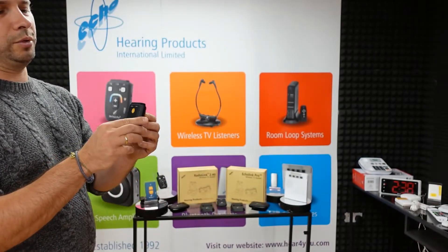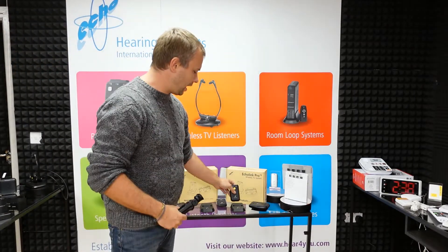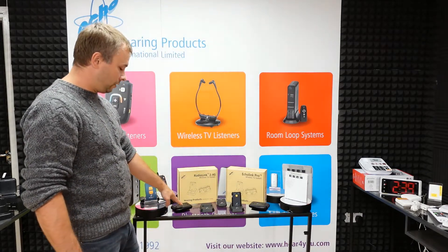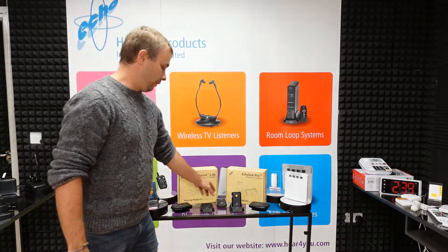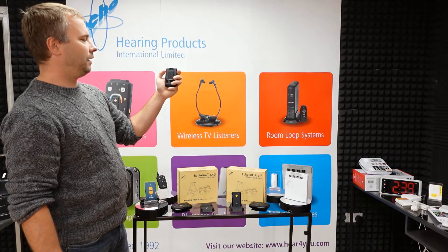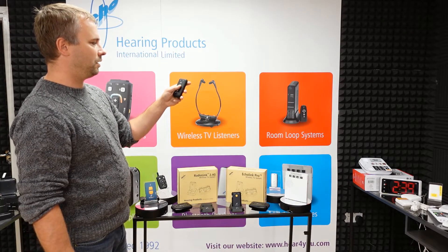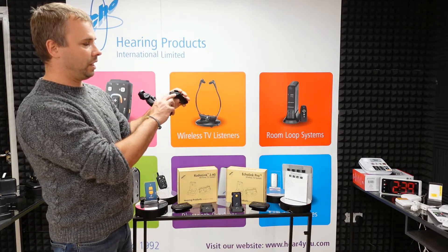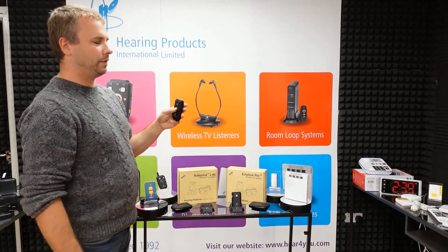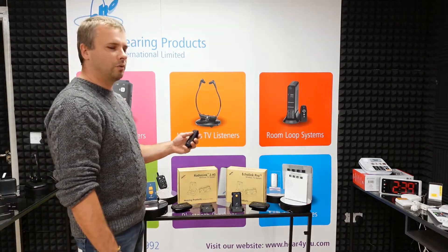For hearing aid users to hear the sound. A similar situation exists with the RadioLink 2.4 gigahertz model — you've got a transmitter which has to be connected to the TV the same way as Echolink Pro, and a receiver that is very similar in size and functions. Both units have a built-in microphone, so you can enjoy conversation as well if you wish. But what is the difference between Echolink and RadioLink 2.4 gigahertz?